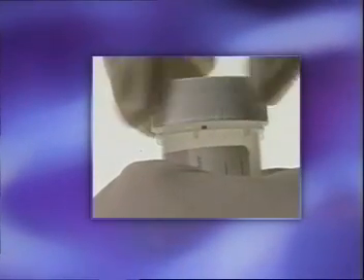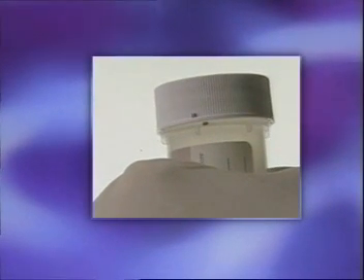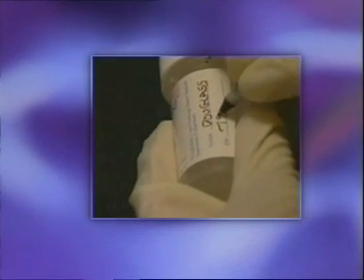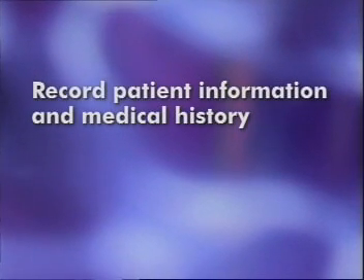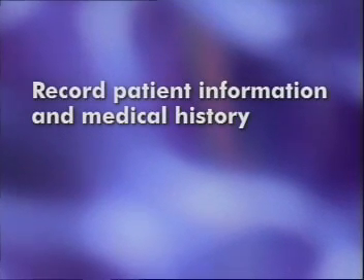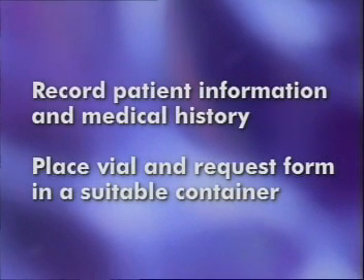Make sure to tighten the cap until the black line on the cap passes the black line on the vial. Record the patient's name and identification number on the PreserveSite sample vial. Record the patient information and medical history on the standard cytology requisition form used by your laboratory. Finally, place the vial and the request form in a suitable container for dispatch to the laboratory.